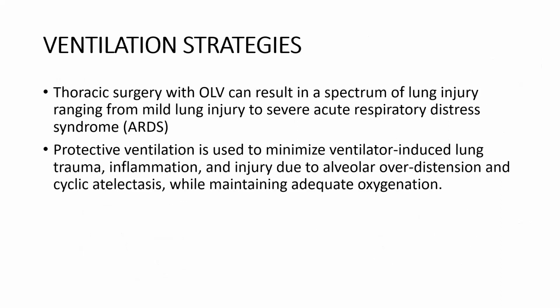Okay, let's talk about the ventilation strategy. Thoracic surgery with one-lung ventilation can result in a spectrum of lung injury ranging from mild to severe ARDS. So to minimize the risk, ventilation strategies adapted from lung protective strategies in the critical care setting are utilized in one-lung ventilation.